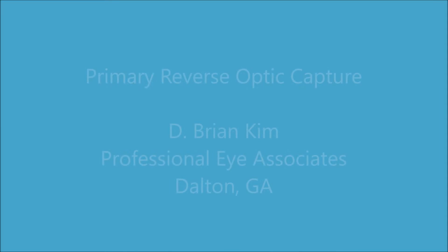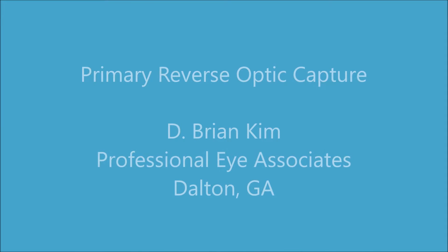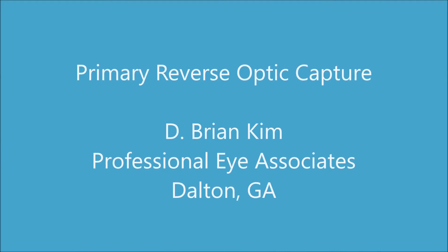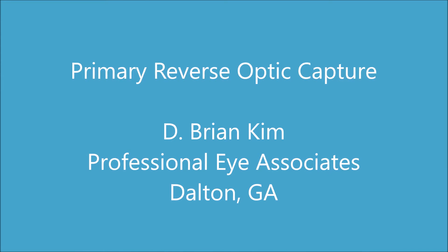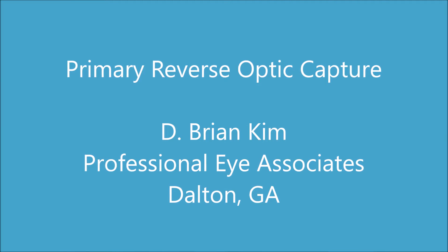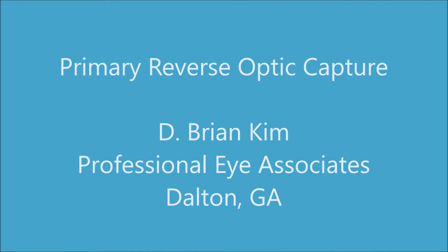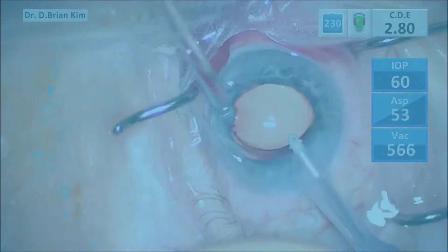Hi, this is Brian Kim. I'd like to share with you two recent cases of primary reverse optic capture for the treatment of negative dysphotopsia. Both of these cases are second eyes, and the first eyes of these patients had 20-20 emmetropic results. However, they had the classic negative dysphotopsia where there was a dark temporal crescent. Rather than exchanging those implants, the patients chose to proceed with reverse optic capture of their second eyes, and this did resolve their negative dysphotopsia.